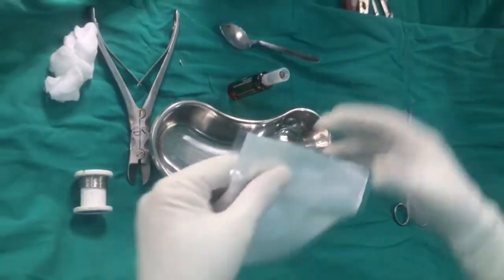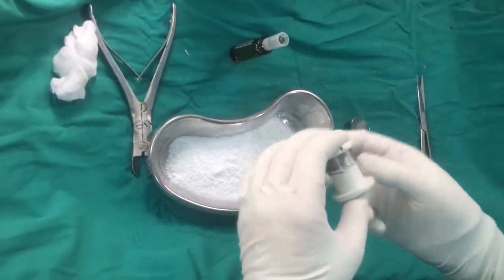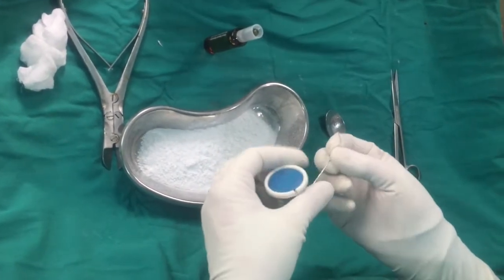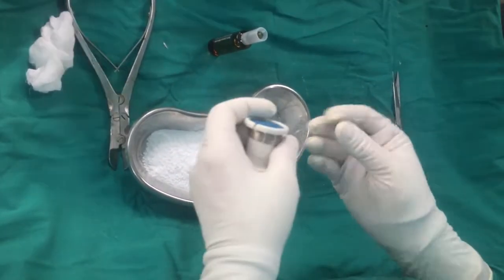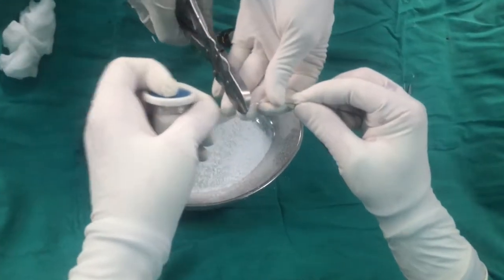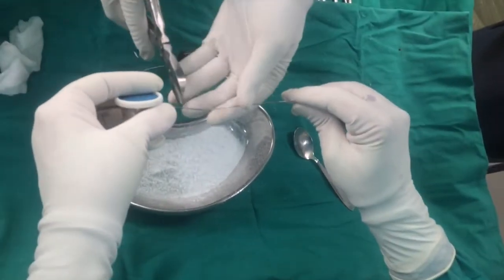First we put our cement powder in the bowl and then we prepare our SS wire. How much SS wire we need to put into a mold — maybe one piece, two pieces, or three pieces — and we should take the wire in small pieces so we can put the SS wire into layers, not in a single space.